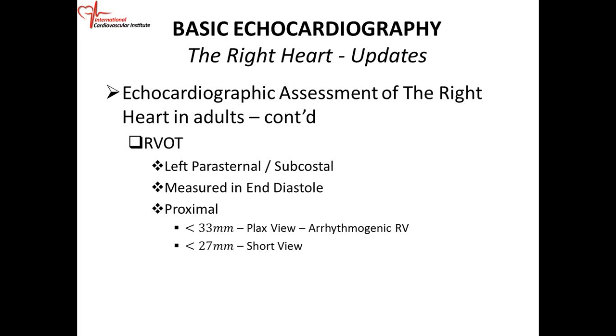I looked at a report last week and they gave an RV measurement of, I think, 4.1. I don't know where to measure.